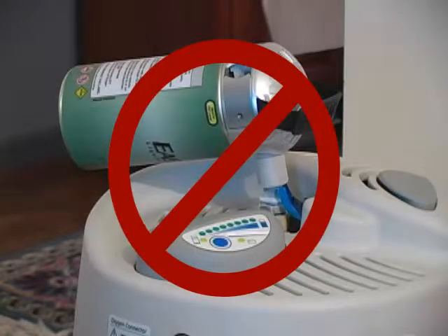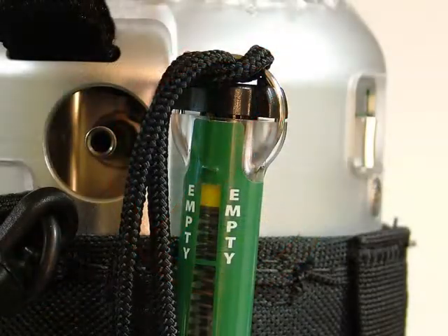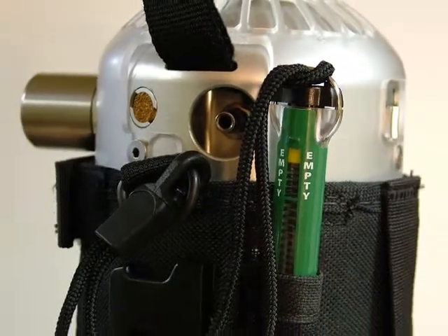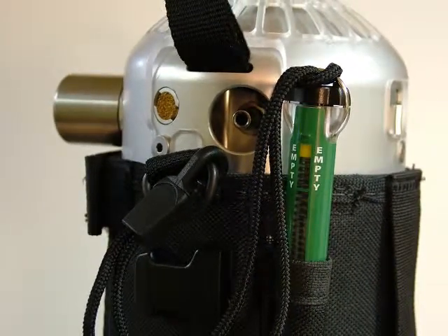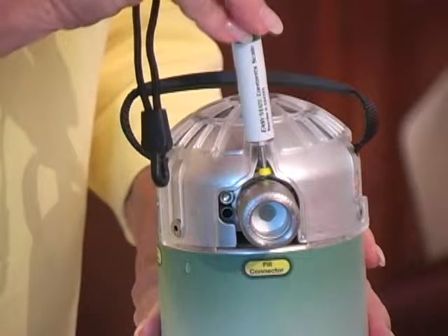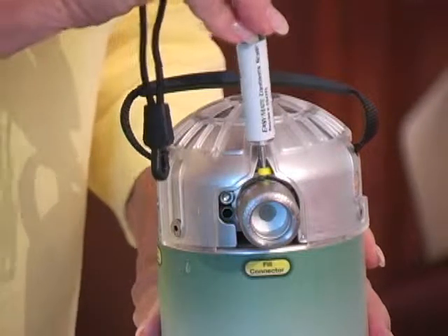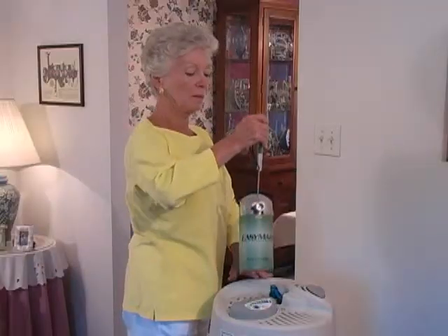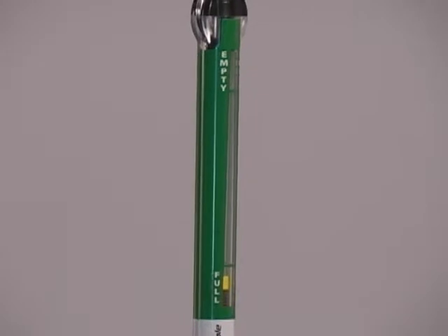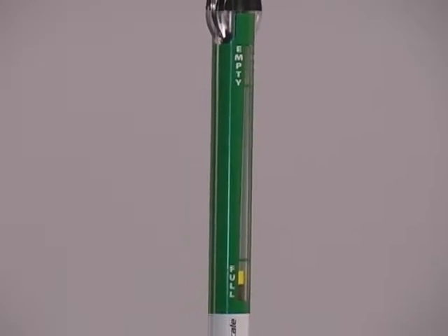Never leave the portable unit unattended during filling. To ensure that you have completely filled your EasyMate, take out the scale attached to the carry bag. Align the yellow tip with the slot above the fill connector. Slide the tip in, then lift up the EasyMate and read the scale. If you have filled the unit completely, the scale will read full.